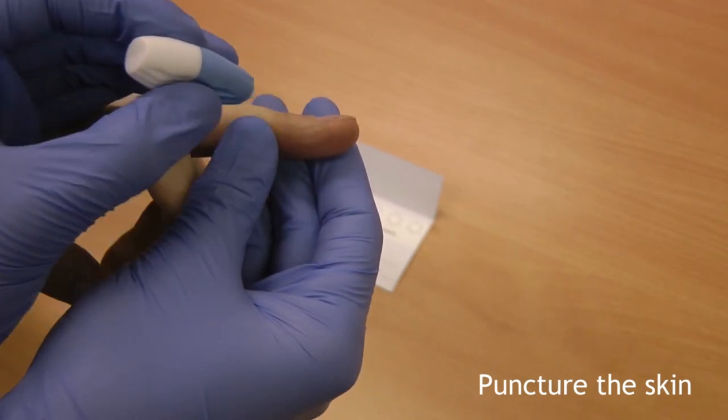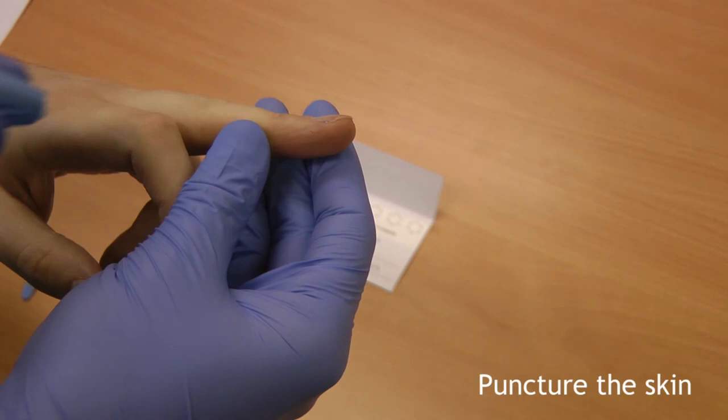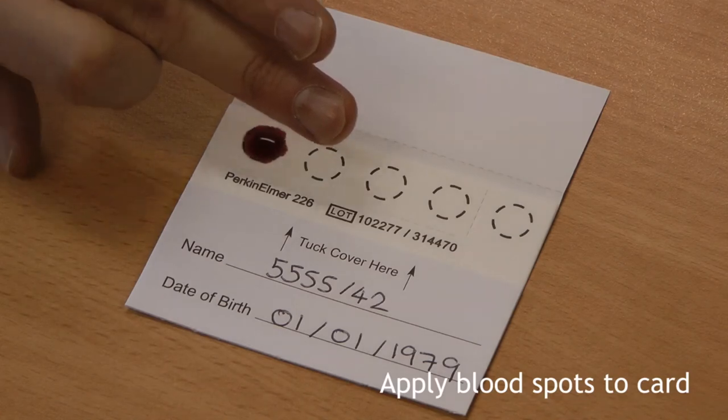Gently apply pressure until the lancet is activated. A clicking sound will be heard when this has happened. The finger should now bleed.